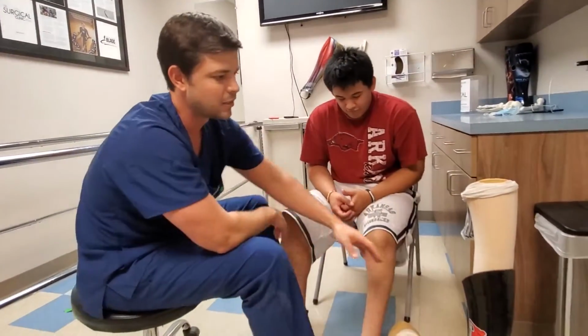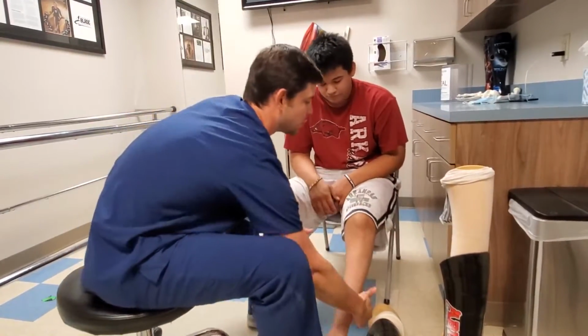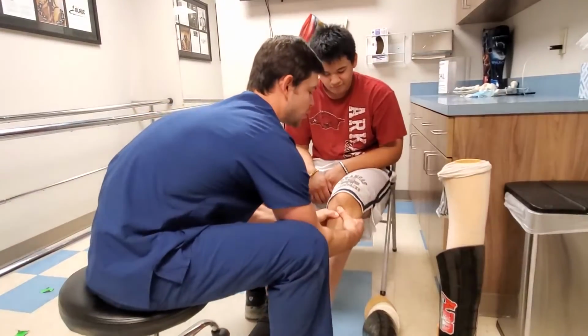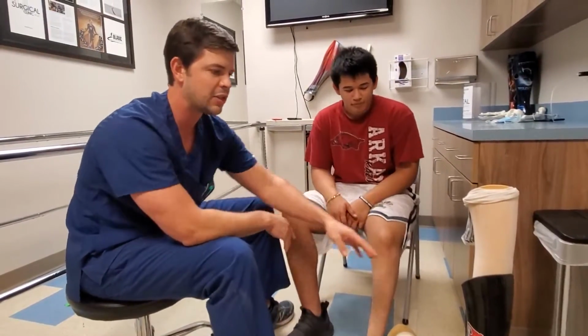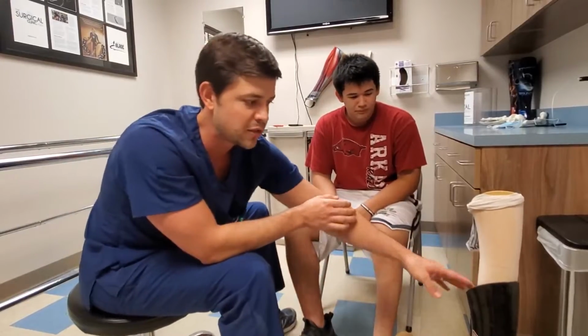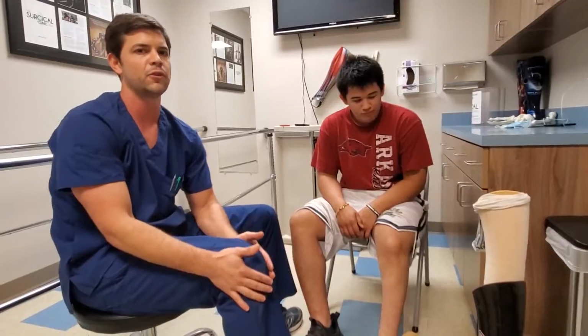And so we always test their leg to see if we can get away with these lower trim lines, by doing quick varus and valgus tests to determine if there's any laxity, and anterior drawer signs to see if they have the strength in the ligaments to preserve their knee joint. Because he's strong and he had these trim lines for about 2 years, we knew he could get away with it again. These trim lines just allow him to use his muscles more because he doesn't need the extra socket around his knee for stability.